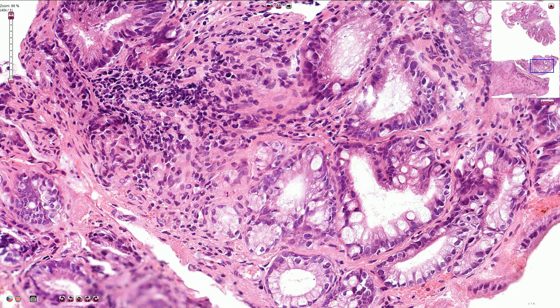Goblet cells are larger cells with distended cytoplasm containing mucin content. Here we have one goblet cell, and another one is here.